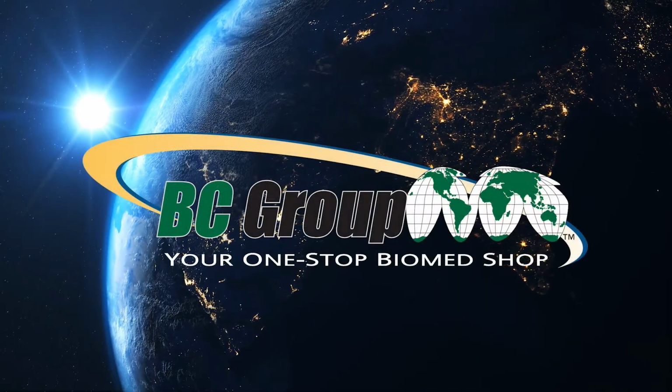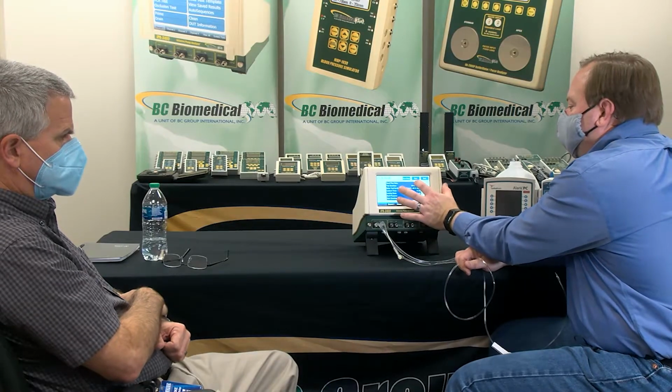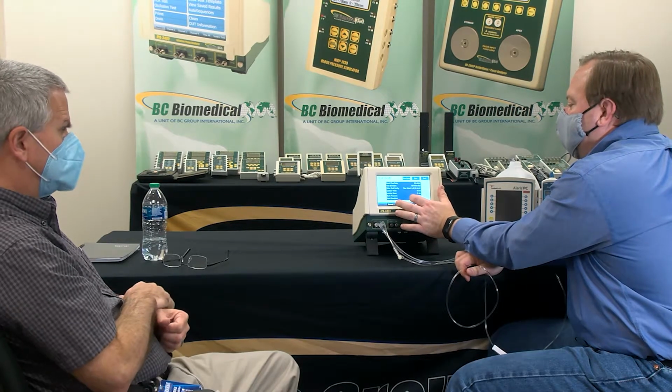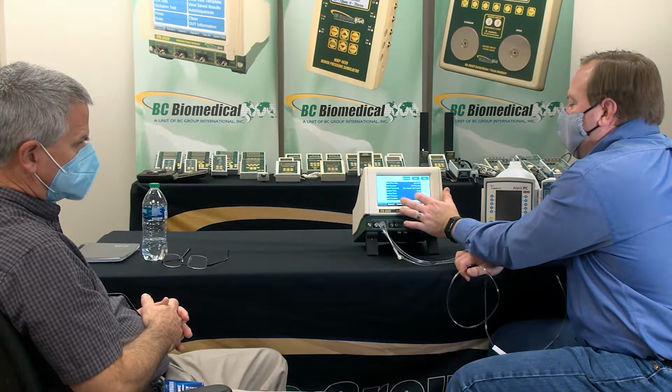Now we'll be demonstrating PCA testing, which consists of a basal flow rate and bolus flow rates with multiple deliveries of injected volume. We'll demonstrate all the measurements and methods for performing this type of testing. The important thing with doing a PCA test is the base flow rate is 20 milliliters per hour, and test duration, that's fine, we'll do an hour.